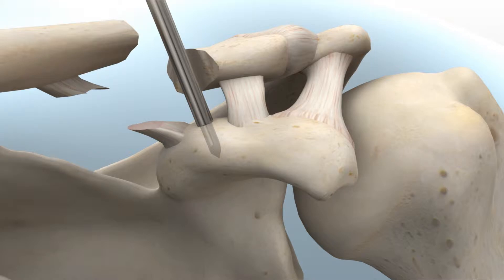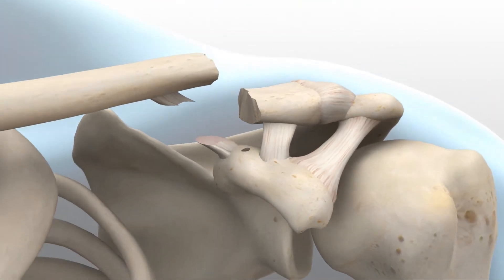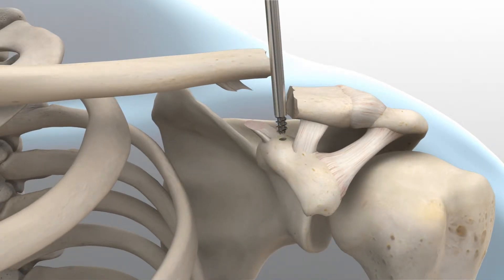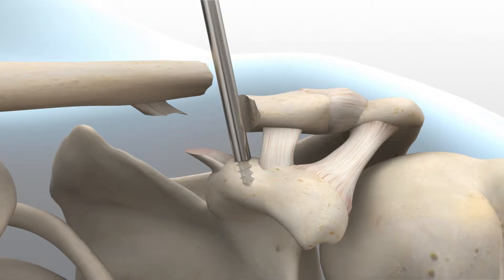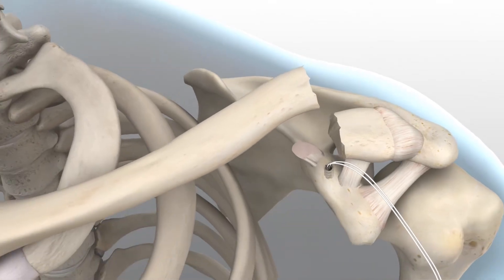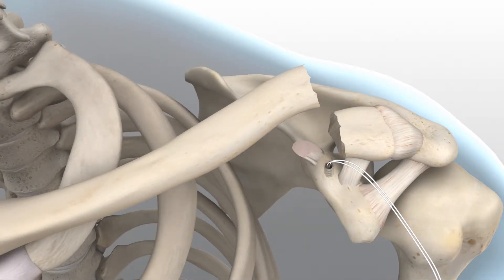Based on the patient's coracoid size and injury pattern, the surgeon has the ability to choose between one or two anchors at their discretion. The anchor is pre-assembled to the suture in the AccuSynch driver. Insert the anchor into the drill hole in the coracoid until the driver interface is barely visible. The shoulder on the AccuSynch driver will prevent inserting the anchor too deep. Release the suture from the handle and position the suture strands anteriorly for use after plate installation has been completed.